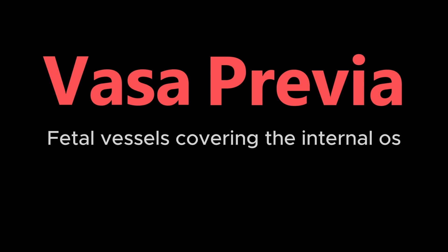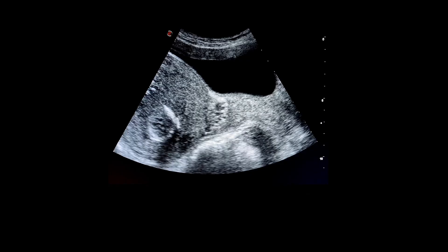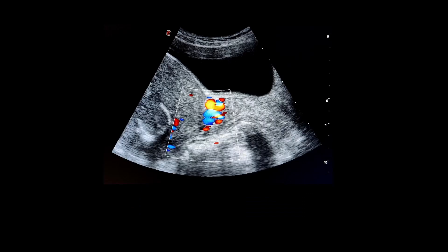The term vasa previa means presence of fetal vessels at the internal os, as seen in figures A and B, which show two types. Type 1 is associated with velamentous insertion of the cord, and type 2 is associated with an accessory lobe of the placenta in which the traversing vessels cross the internal os. We should document the fetal heart rate in those vessels, as in this case which showed fetal vessels covering the internal os with fetal heart rate on waveform.